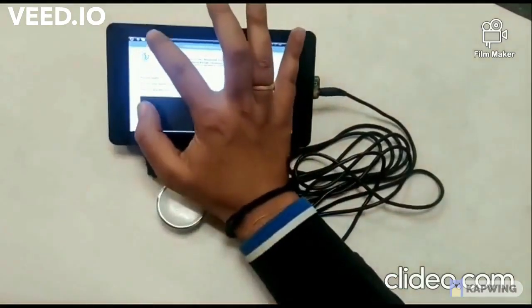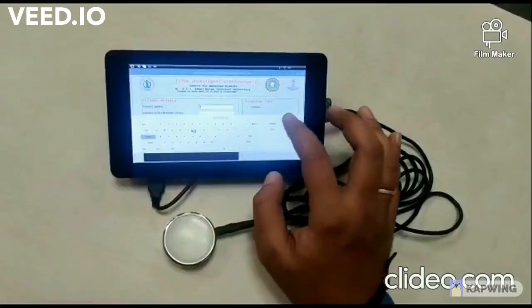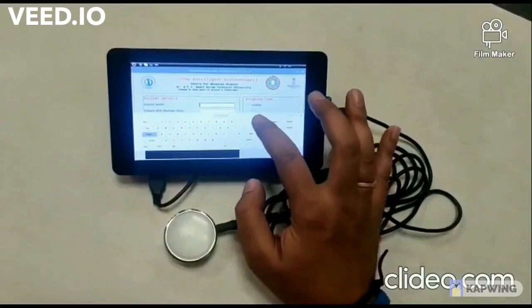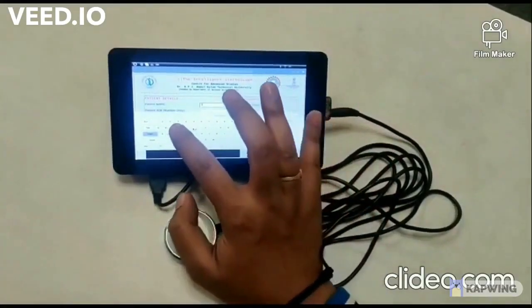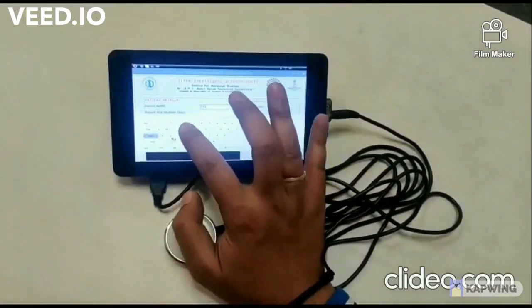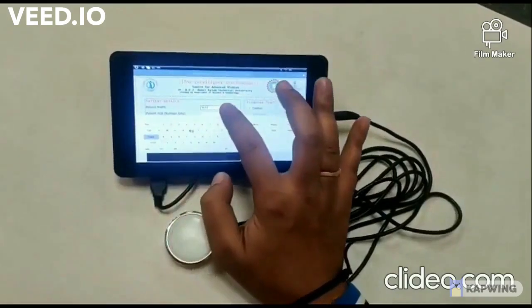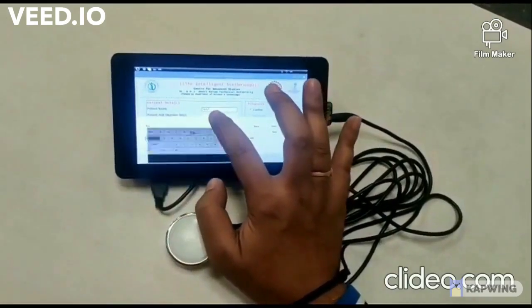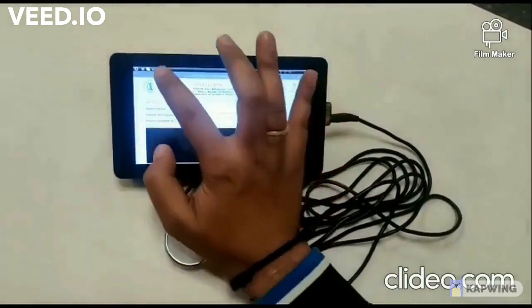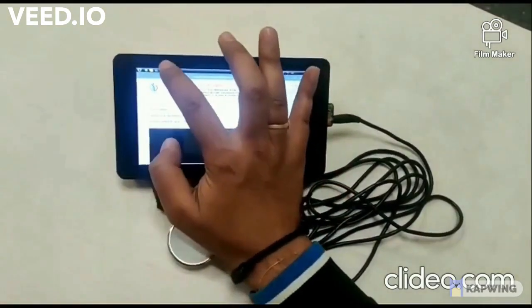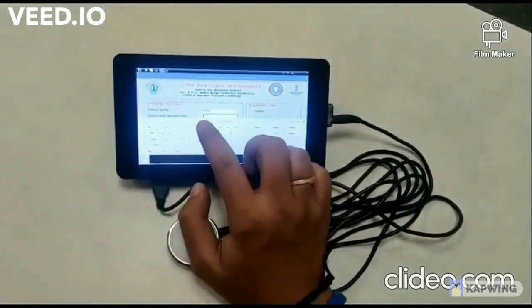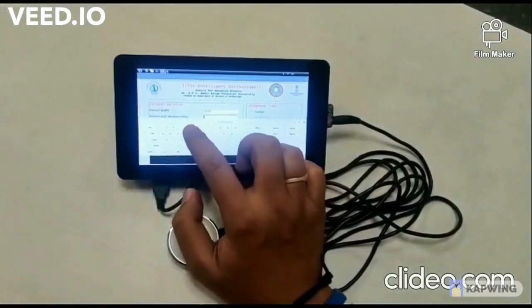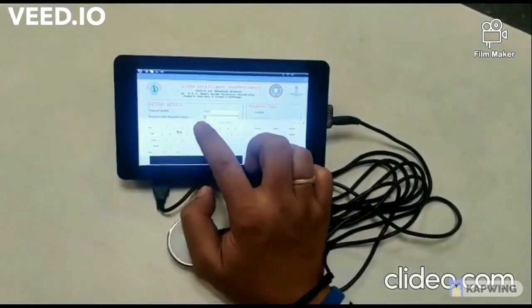The user can click on the keyboard to enter the details: patient name, patient age, and patient gender.